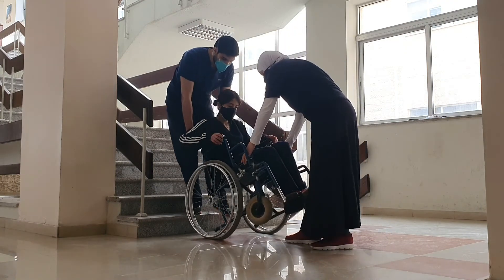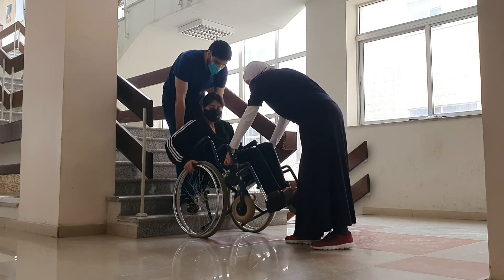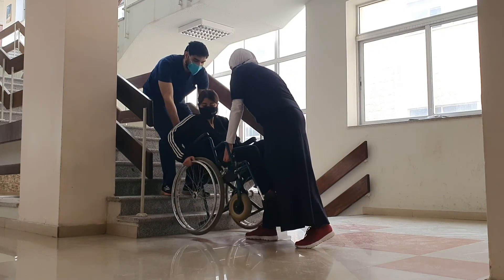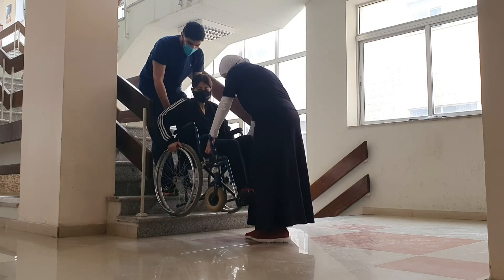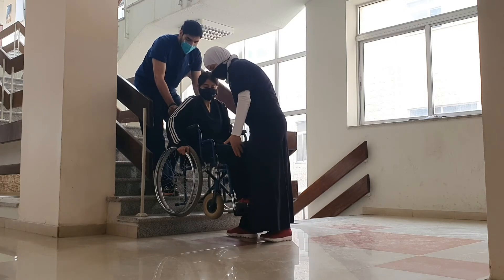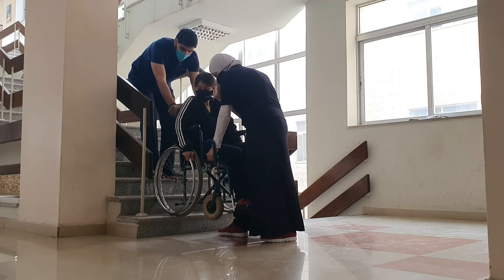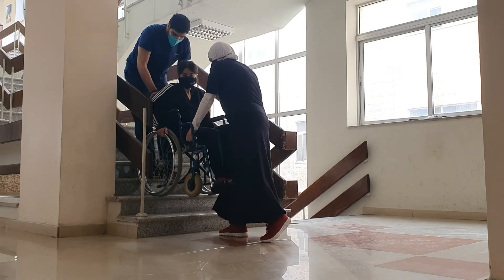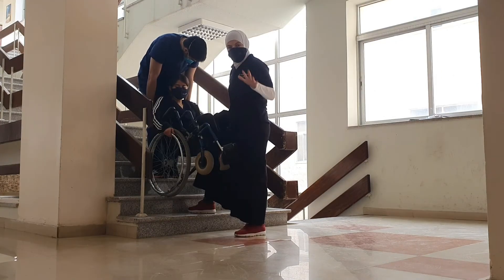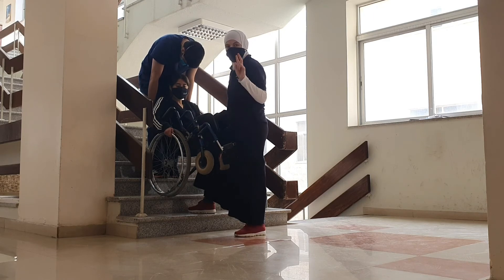The wheelchair user, as team leader, does the count. First, we do the wheelie and move back towards the step. Then the count: one, two, three — and we move up. We then take a moment to relocate. The front person moves a step forward, the rear person takes one step up, and then another count: one, two, three. We keep going up like this, one step at a time. To make the technique easy, we should always try to maintain the wheelie position throughout.